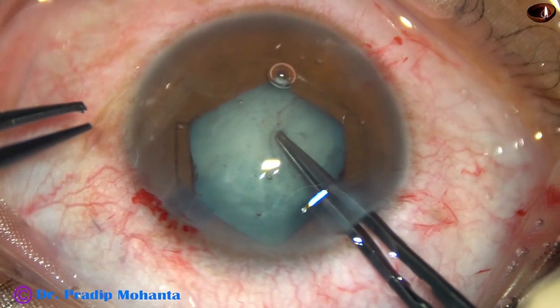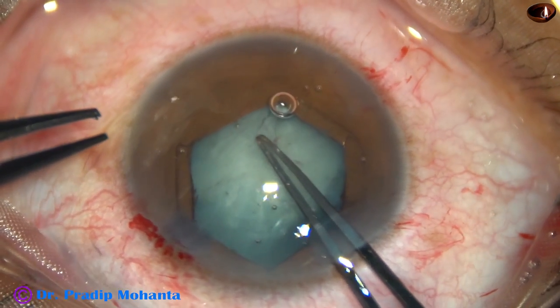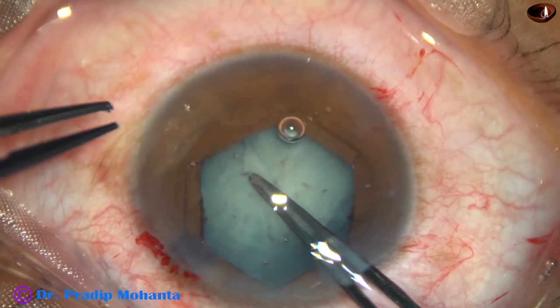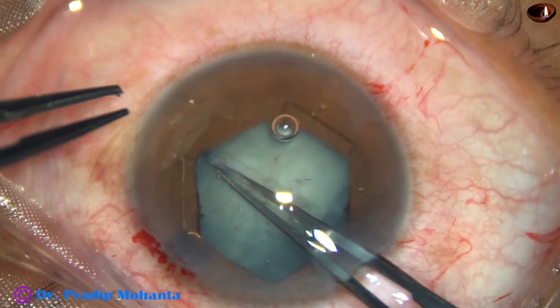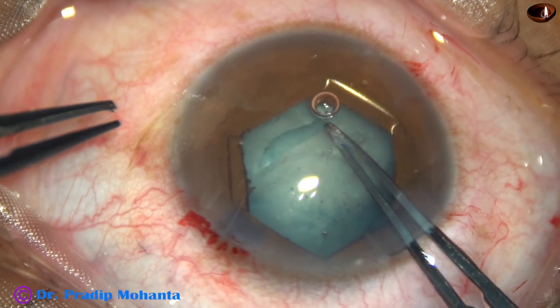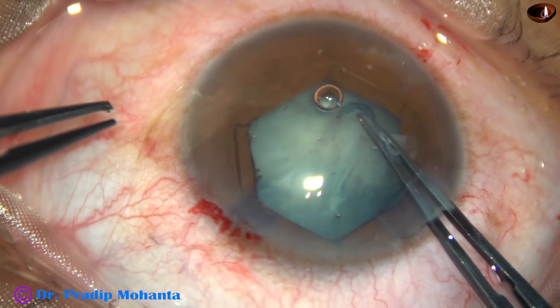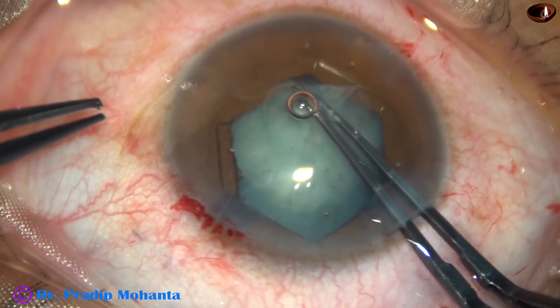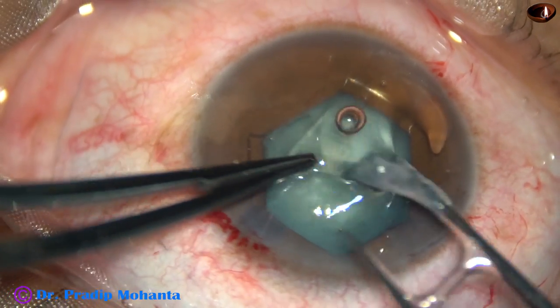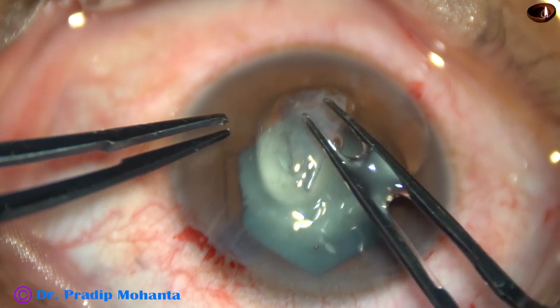Now my plan is to remove only the plaque. Inferiorly I cannot see the plaque, but I hope that this plaque will not extend too far to the periphery and I will be able to remove it. I have been able to remove the plaque and the rhexis is the size of this plaque — this is a thick fibrous plaque involving the anterior capsule.